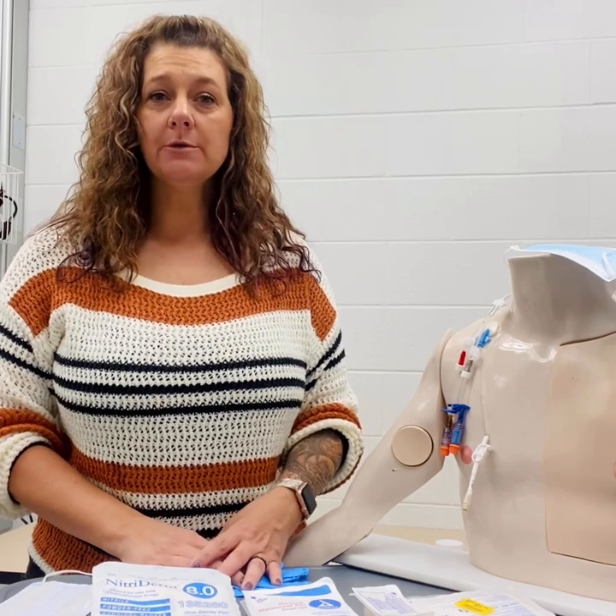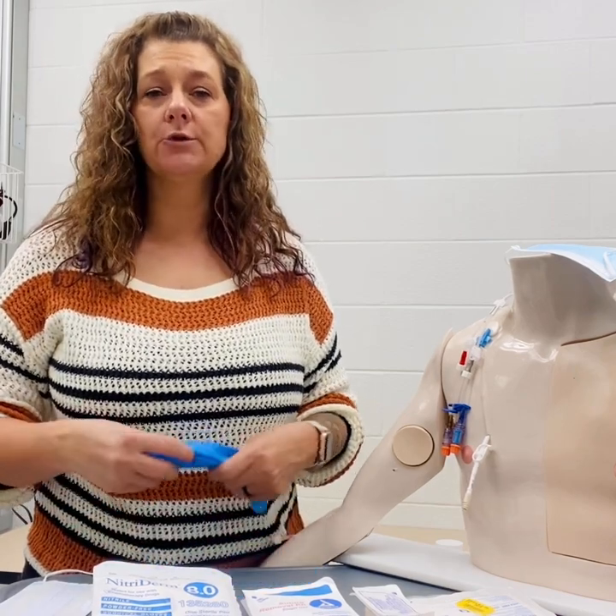Hello, this video is to show you how to remove a central venous catheter. To begin with, we always want to verify the physician's order prior to removing. Secondly, if another IV line is needed, we'd like to start that prior to removing the old central line.